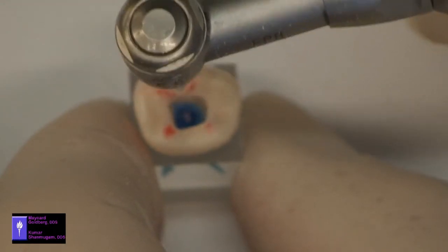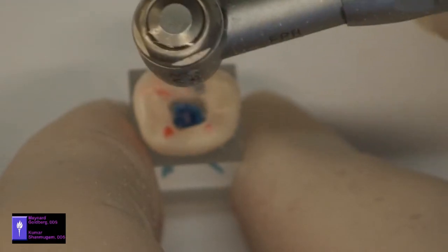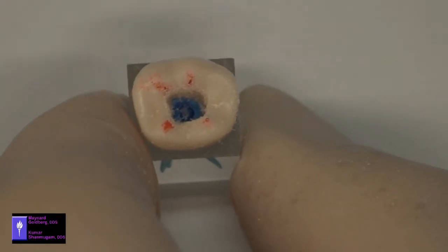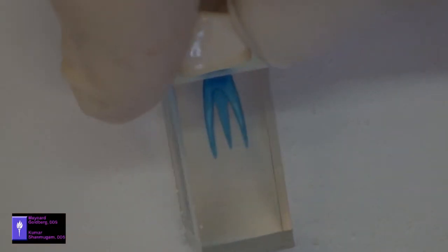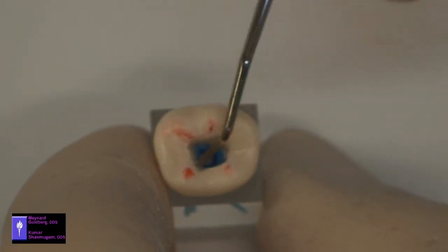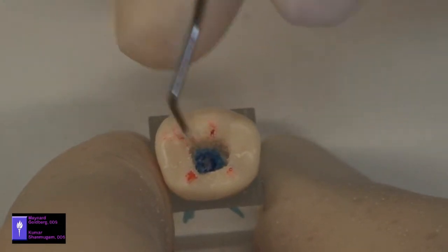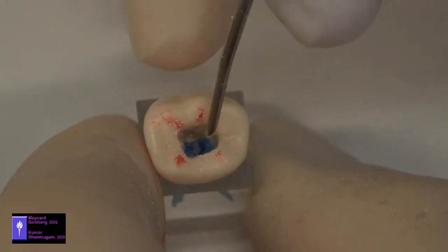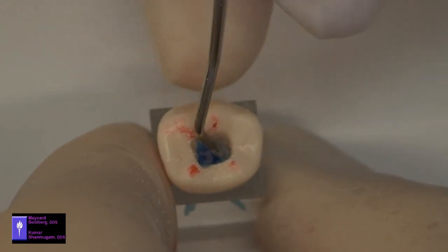And we've now accomplished a correct access cavity. We have not created any perforations in the floor of the chamber. All the walls taper from each other. There will be freedom of motion with any file that we put into this tooth, into these canals. They will not bind on the walls of the chamber.